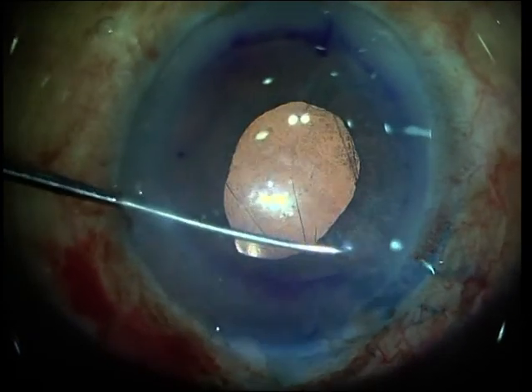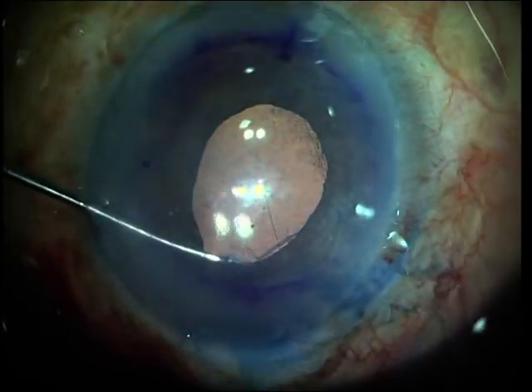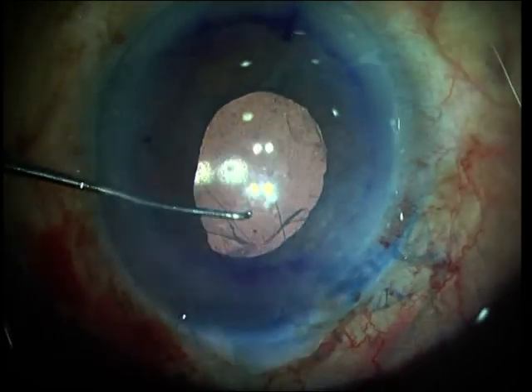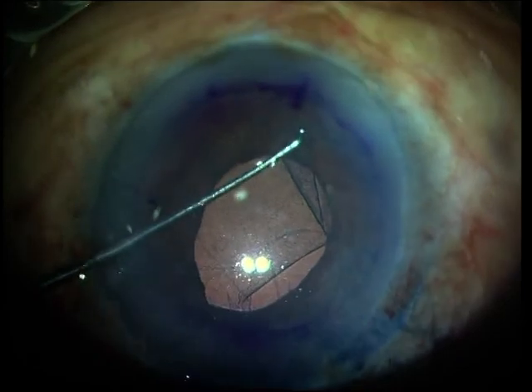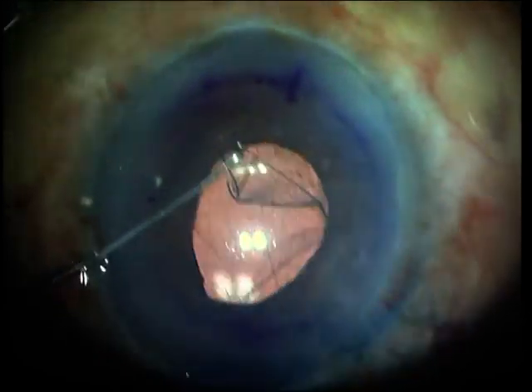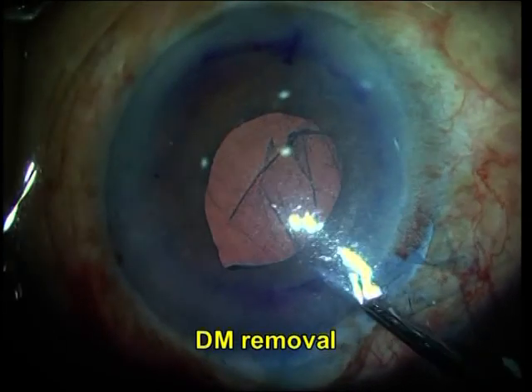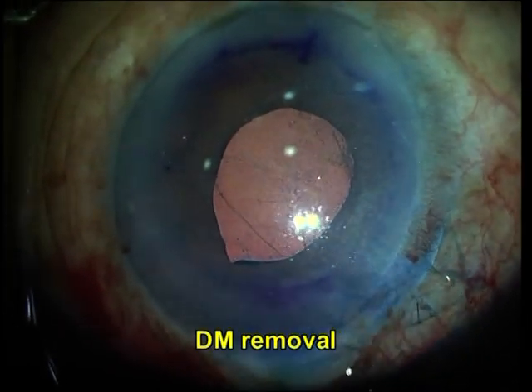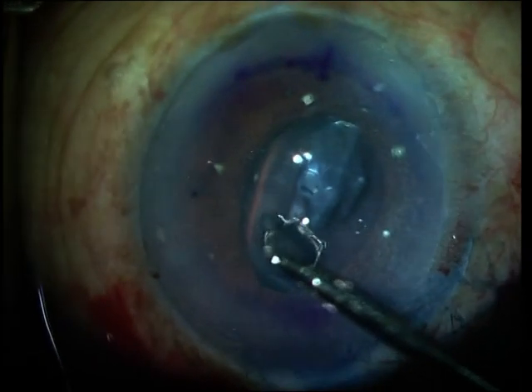The hook is used to detach the Descemet's membrane all around the cornea. Once detached from the peripheral cornea, it is carefully rolled onto the pupillary plane. Totality of removal of the Descemet's membrane from the recipient is very vital for the perfect adhesion of the donor button to the recipient bed.